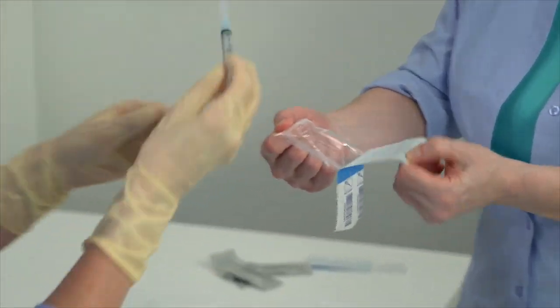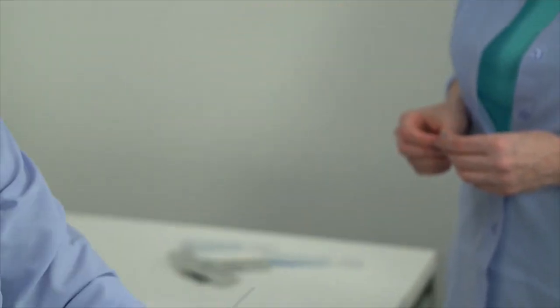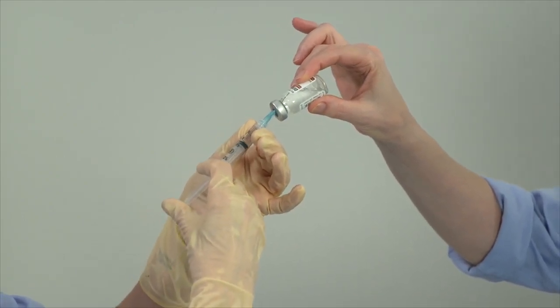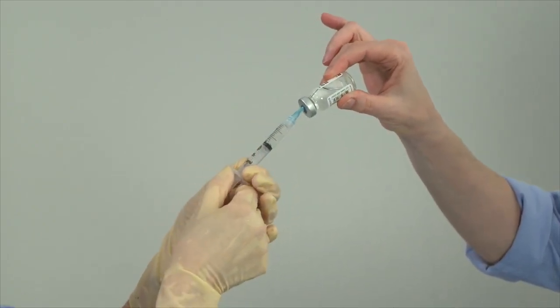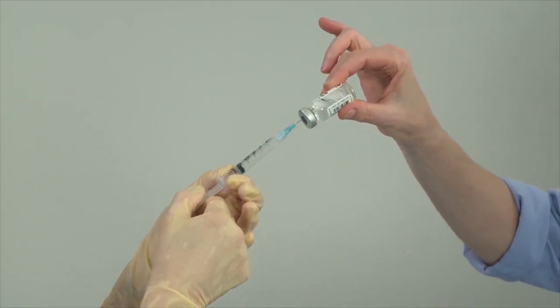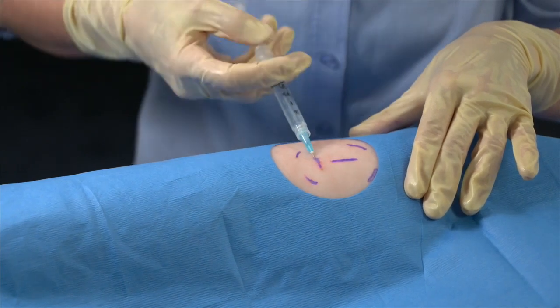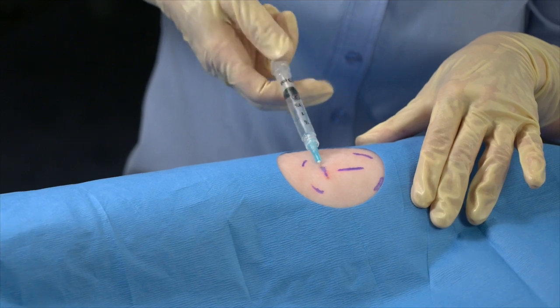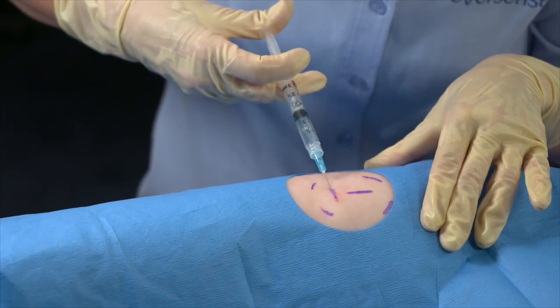Now, with the help of your assistant, draw up approximately 2.5 milliliters of lidocaine sterilely. Inject the lidocaine 1 milliliter at the incision line and 1 milliliter along the vertical sensor pocket path as follows. Advance the needle into the planned incision line at a 20-degree angle. Aspirate for blood return. If blood appears in the syringe, remove it and redirect the needle, repeating the aspiration step. Then inject the lidocaine while slowly withdrawing the needle along the planned incision line.